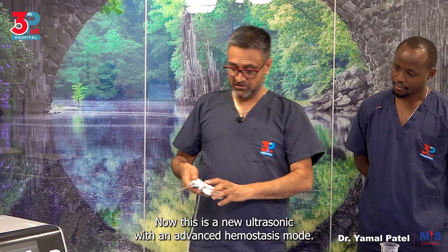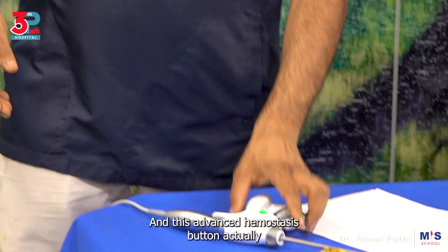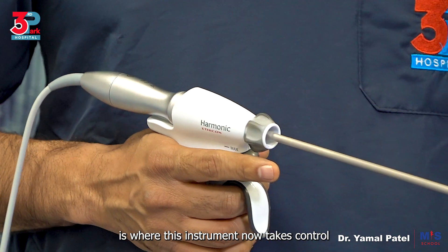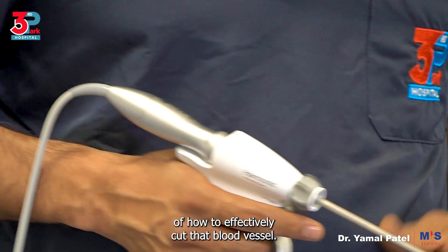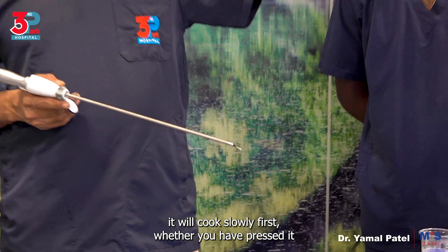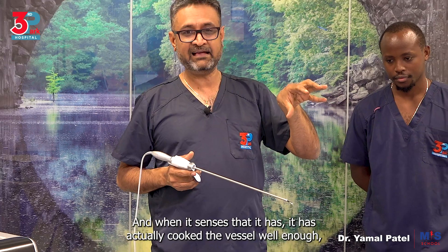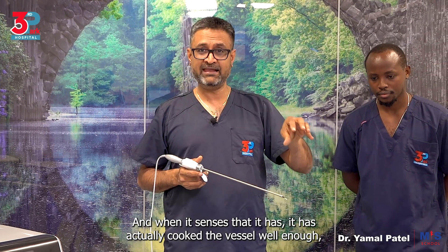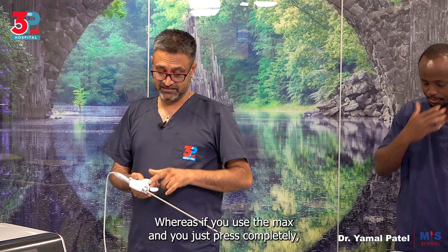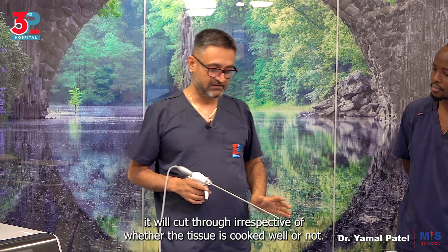This is a new ultrasonic with an advanced hemostasis mode — you can see this green button here. This advanced hemostasis button is where this instrument takes control of how to effectively cut a blood vessel. When you activate it with this button, it will cook slowly first whether you have pressed it completely or not, and when it senses that it has cooked the vessel well enough, then it moves faster and cuts through. Whereas if you use the max and just press completely, it will cut through irrespective of whether the tissue is cooked well or not.